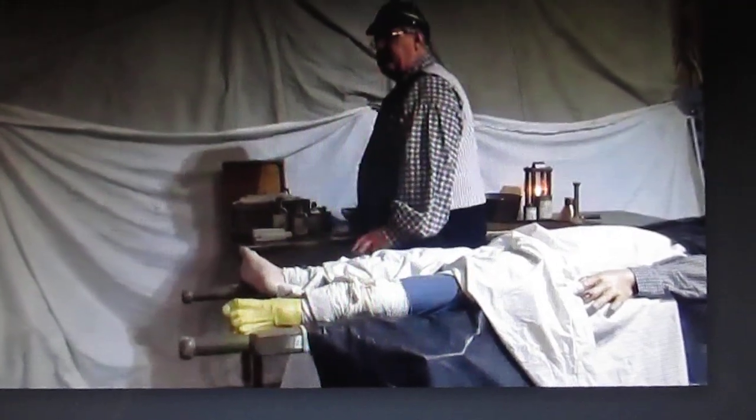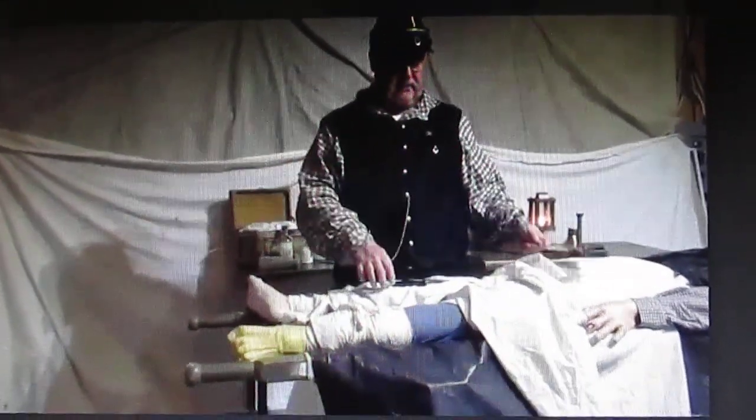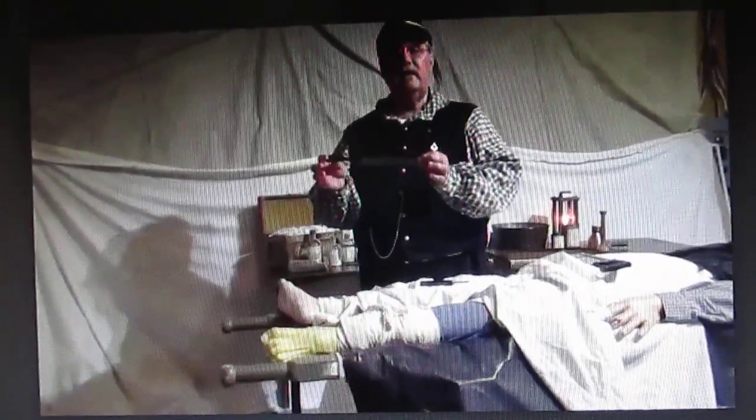Now, we did have 3 different saws that we could use during this time period. The capital amputation saw was basically to take off legs. The metacarpal saw was to take off feet and hands.